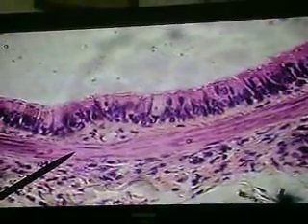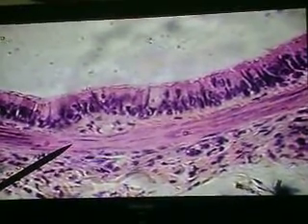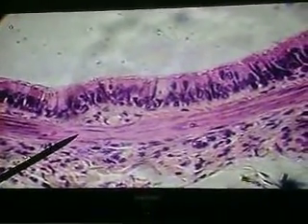What is fascinating about this, Roy, is the well-developed smooth muscle. See? Roy, do you want to say something on this, as it relates to asthma? Any comment? Okay, maybe not. Dr. Thomas says maybe your pathology is not to that level yet, so we will just stick with the basic anatomy. Very good.